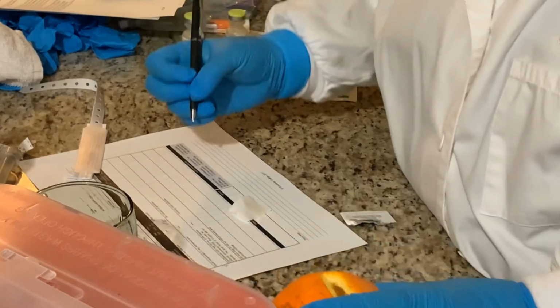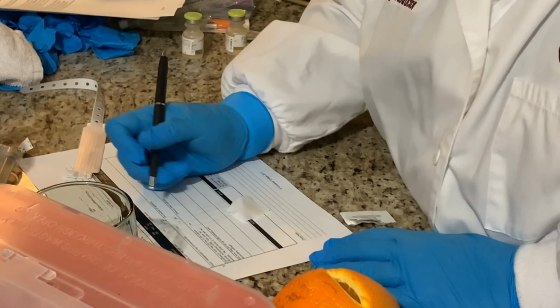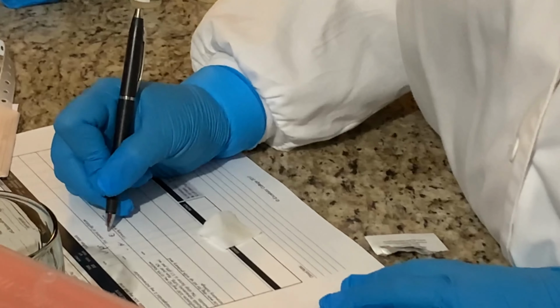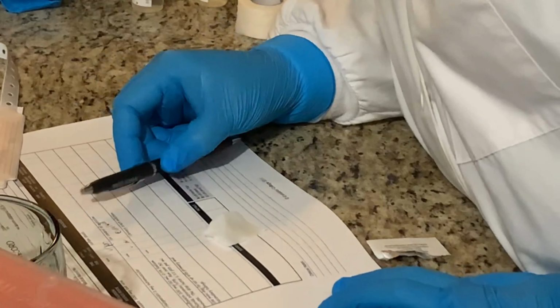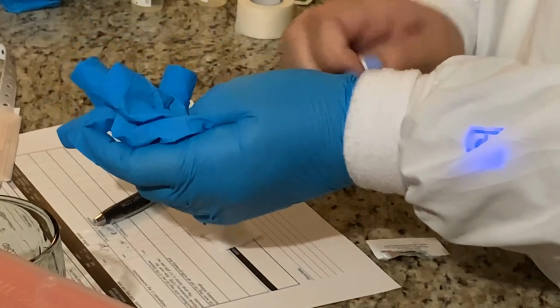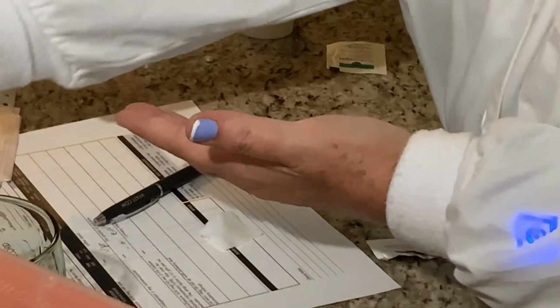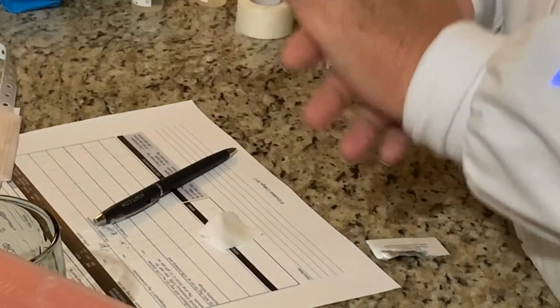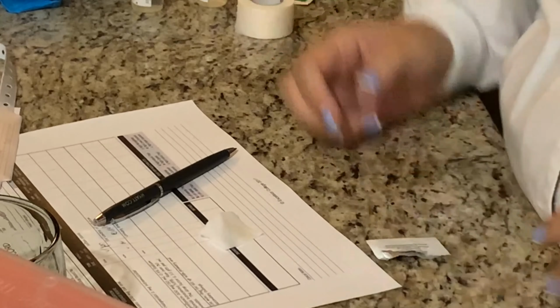Okay, and then I'm going to document that I gave her her Haldol, and I'm going to put that I gave it in her right deltoid. And I'm going to remove my gloves, do my hand sanitizer, and see if she needs anything else. And that's Module 7.